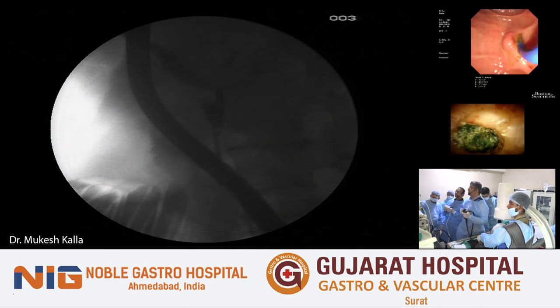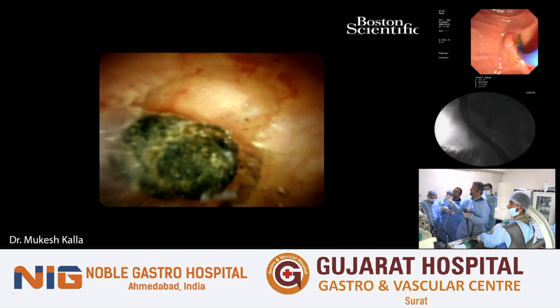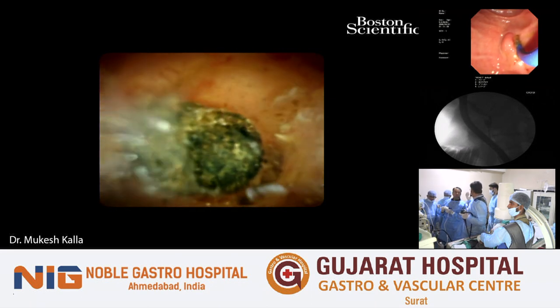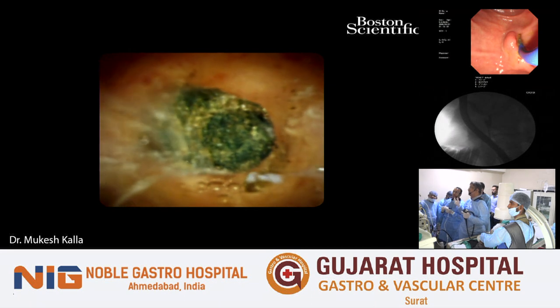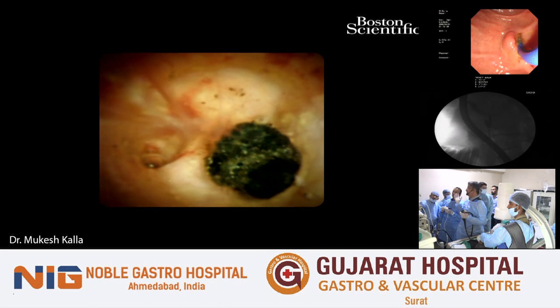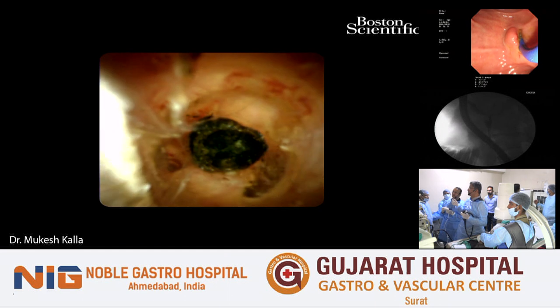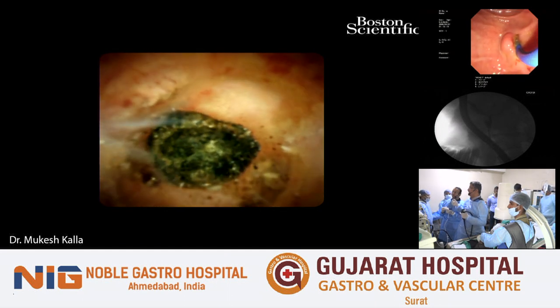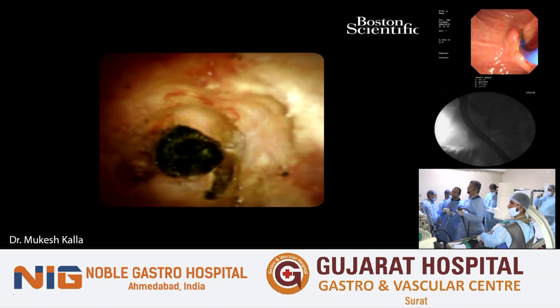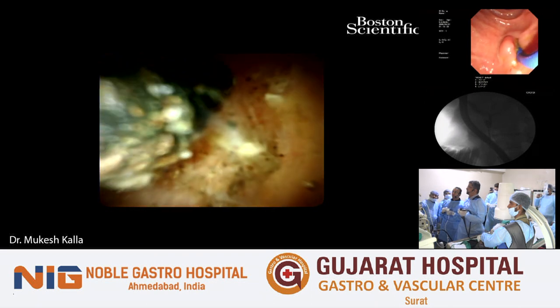There is a small culprit, which was coming down at the junction of the cystic duct and CBD. It looks like a small stone. I don't think we need to deal with this stone with laser at all. We can use a basket, which will be a demonstration for the use of the basket. And we can do laser for another patient. Dr. Yogesh told me that they have one large 2.5 centimeter stone as well.